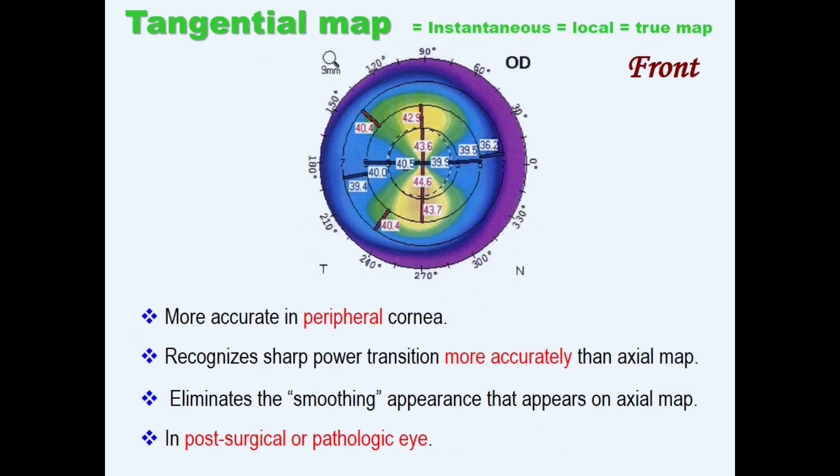Tangential or local maps are useful for evaluating the corneal shape, but are not recommended for routine use because the measurement noise can obscure the true optical quality of the cornea. However, these tangential maps are extremely useful in demonstration and measurements in both surgical and pathological corneas.